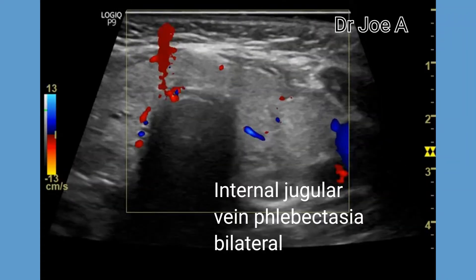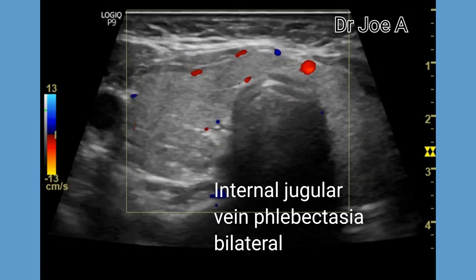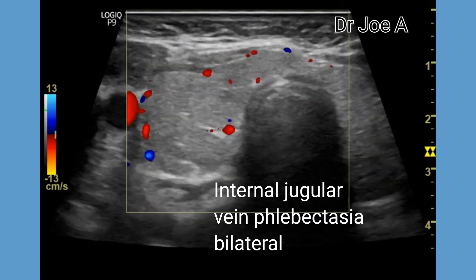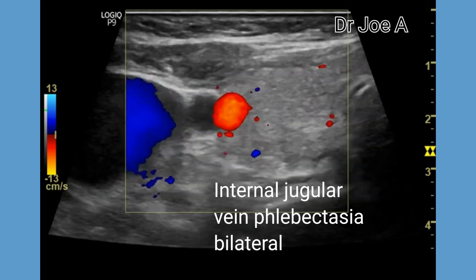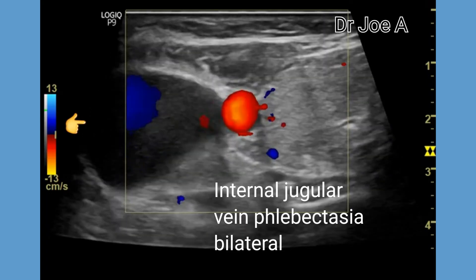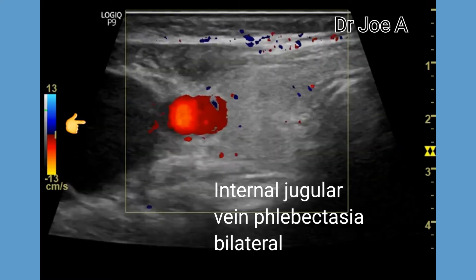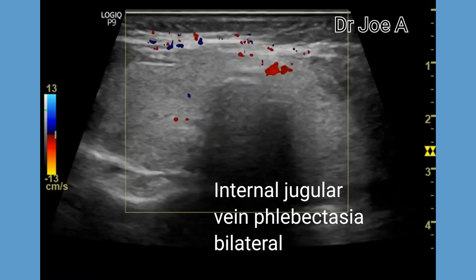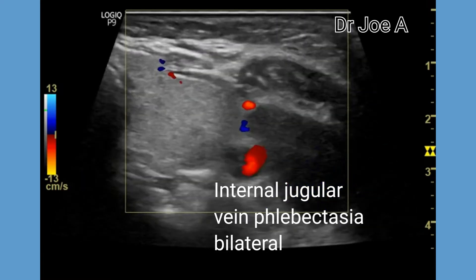Internal jugular vein phlebectasia is a congenital fusiform dilatation of the internal jugular vein. In this case, it is bilateral. An internal jugular vein diameter of more than 15 mm is considered as phlebectasia. In this case, the diameter is more than 25 mm.